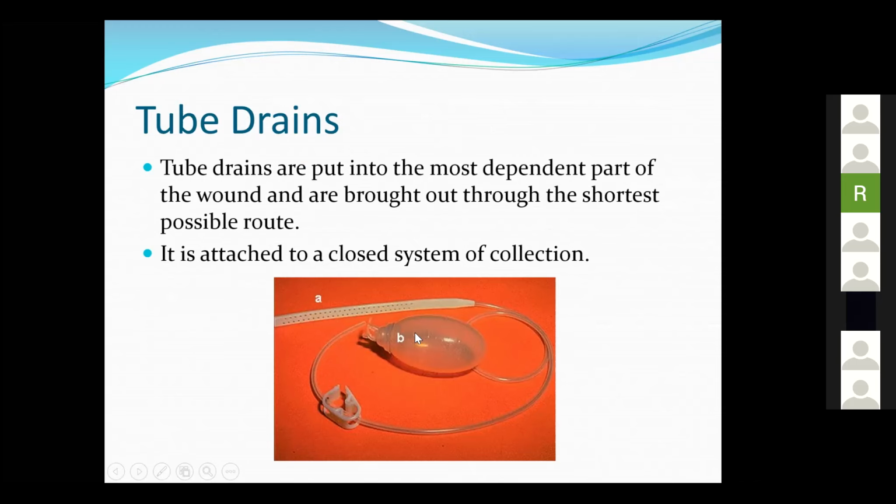This has a suction or a vacuum to it. The tube drains can be without the vacuum. You can connect it to bags like a urine bag or nasogastric bags. You can do that also. And it is used for a shorter period of time.